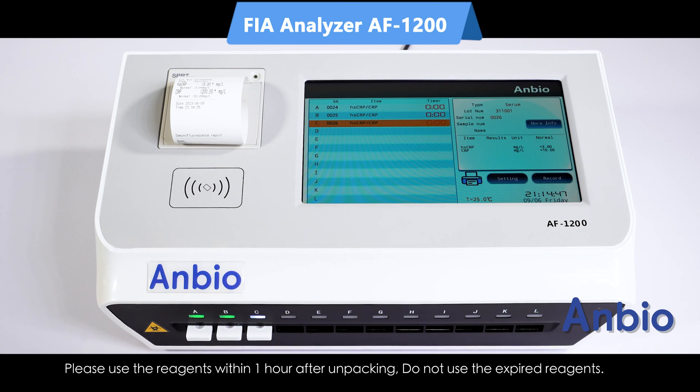Please use the reagents within one hour after unpacking. Do not use the expired reagents.